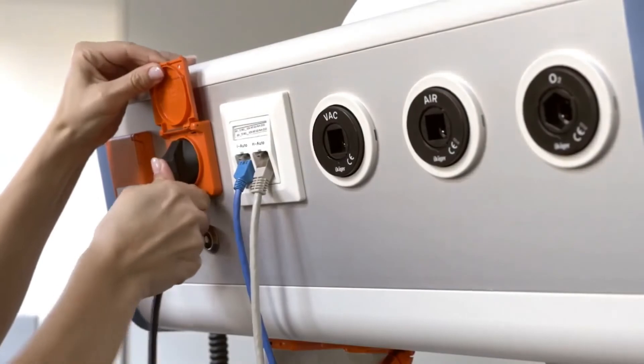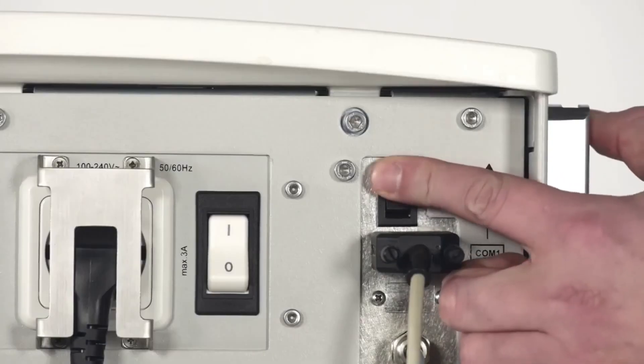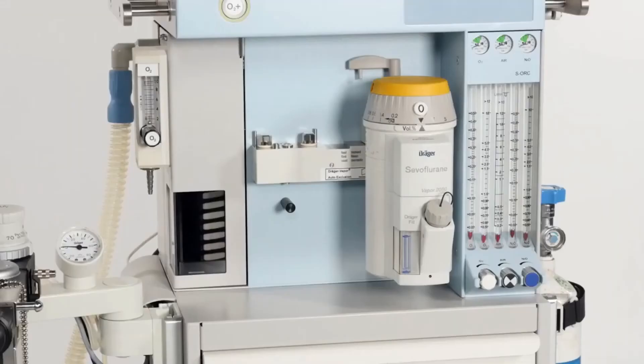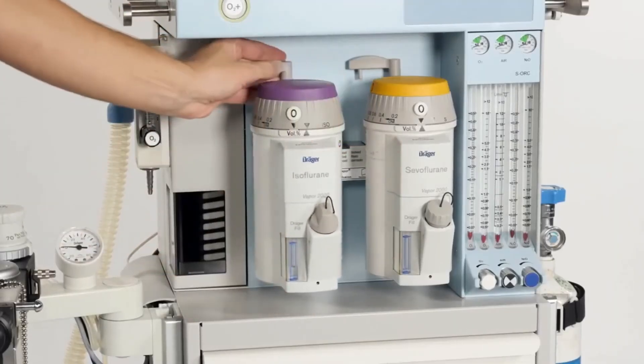Push the power plug into the supply main socket. Switch on the machine by using the on-off switch on the rear of the machine. Install the vaporizer onto the mount of the Fabius Plus XL.